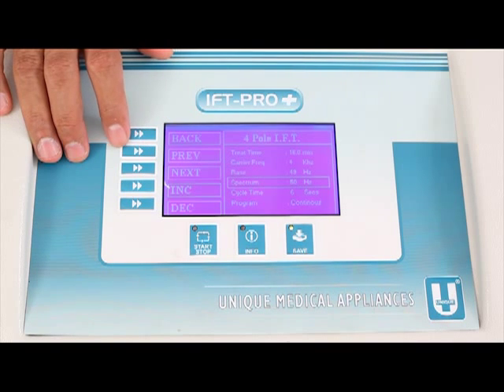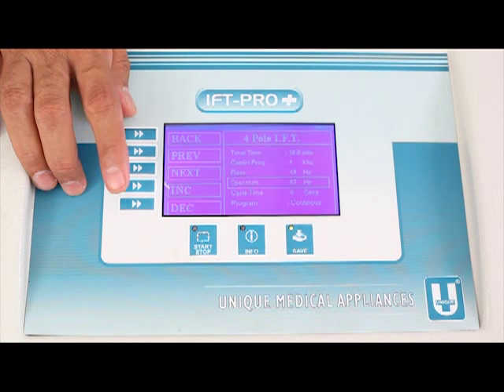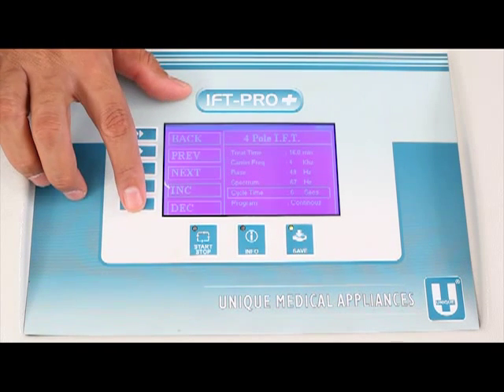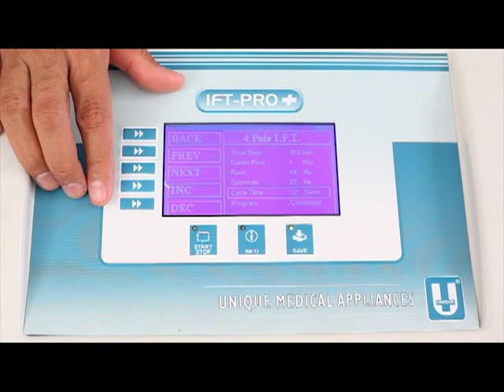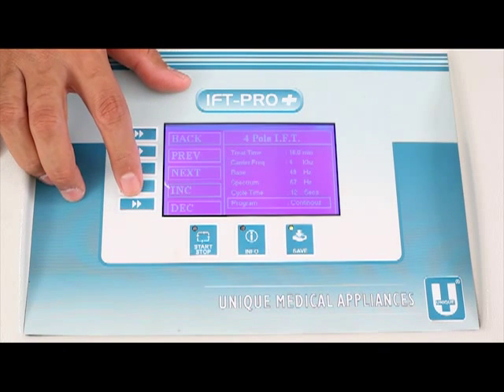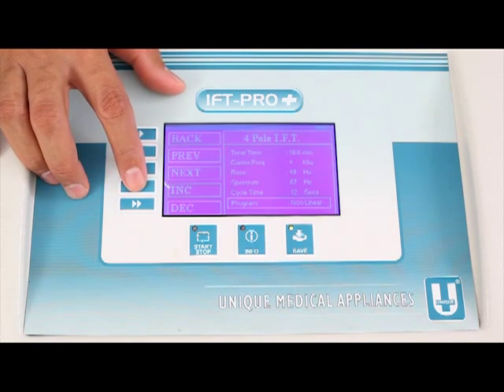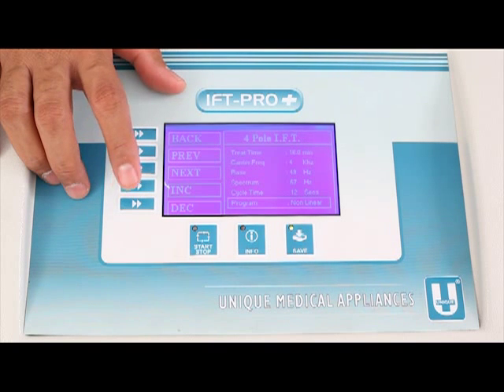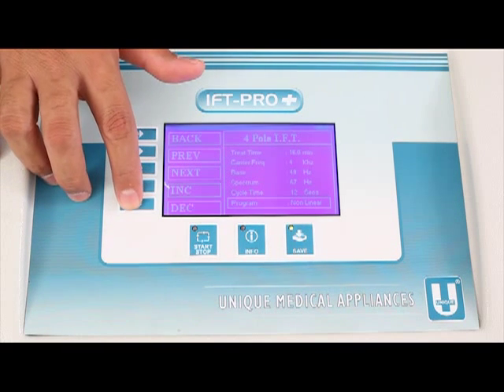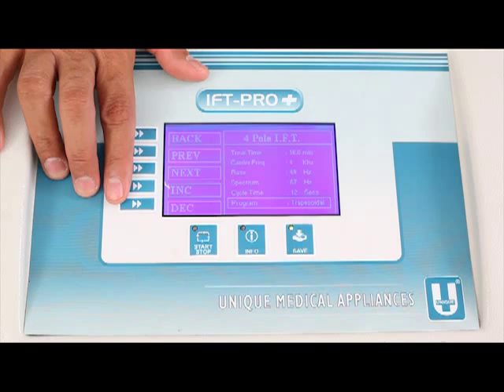Moving to the next parameter: Spectrum 50 Hz. Similarly to base, you can increase or decrease the spectrum using F4 and F5. Pressing F4 increases it to 67 Hz. Using F3 again moves to Cycle time 6 seconds, which offers an option between 6 and 12 seconds. Then the Program parameter cycles through: continuous, linear, trapezoidal, and nonlinear. A longer beep and repetition indicates the end of the cycle. Selecting program trapezoidal completes parameter selection.